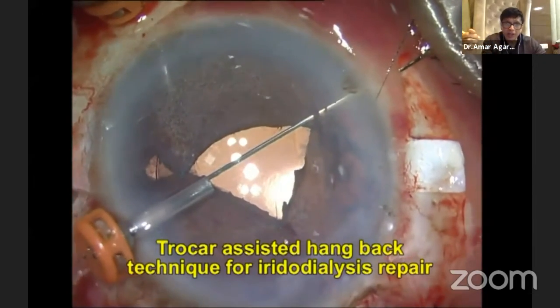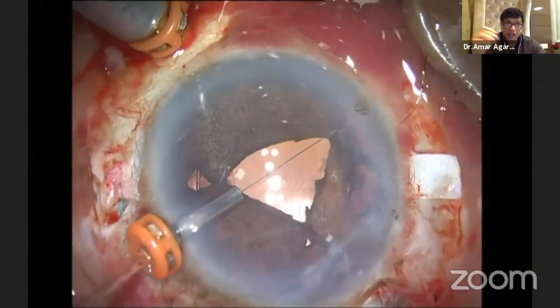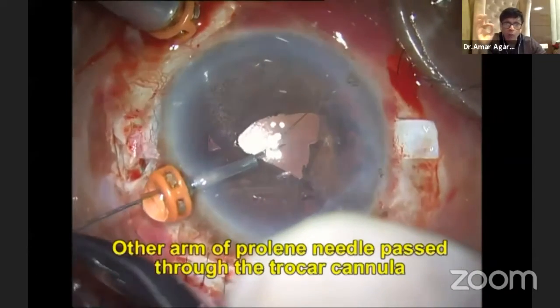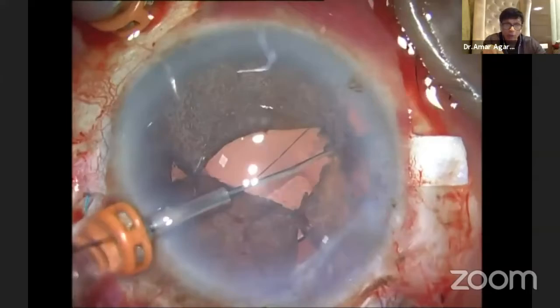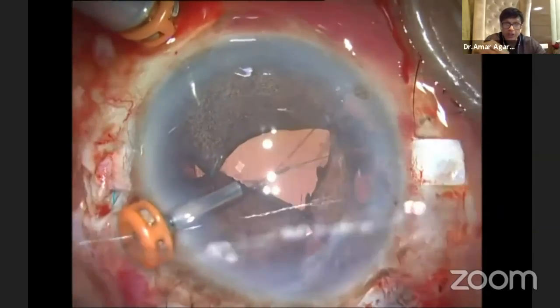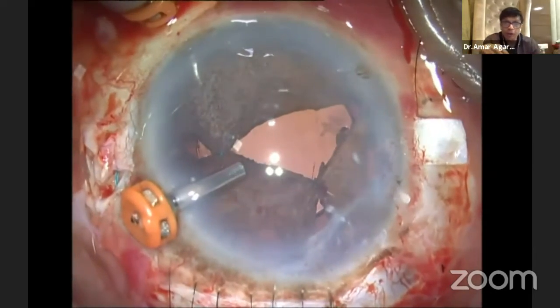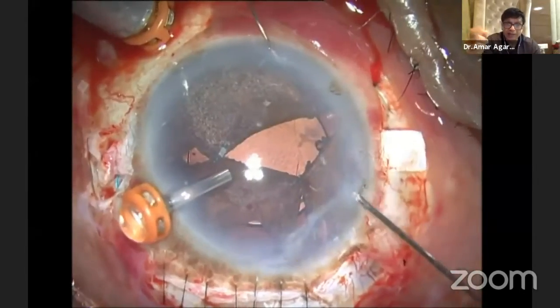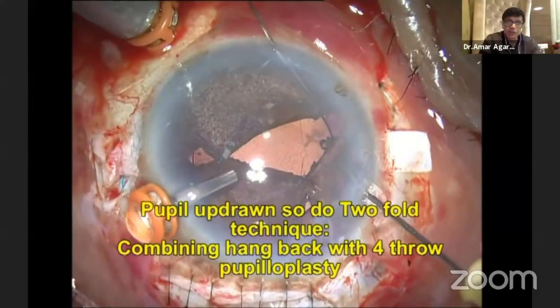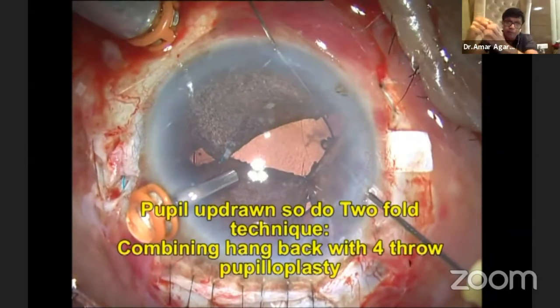One has come out and now I'm going to take the second arm. Remember, fluid is always on — my infusion cannula is always on, so fluid is always in the eye and there is no chance of the chamber collapsing. Now you can see it's pulled up that side. All I need to do is suture it and bury it. But when you pull this up, see what has happened — the iris goes up. So then you do the twofold technique.